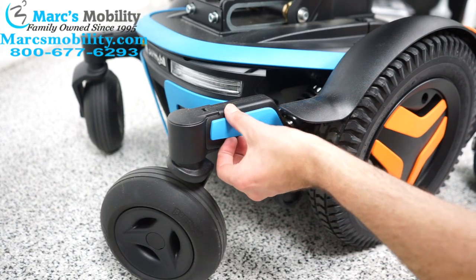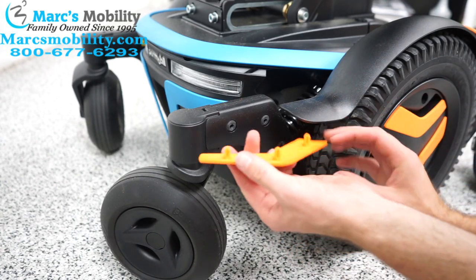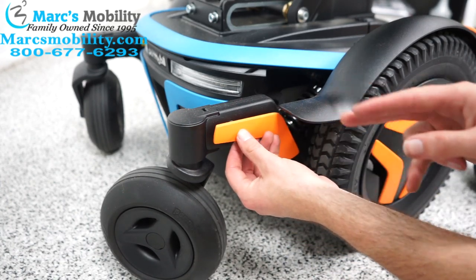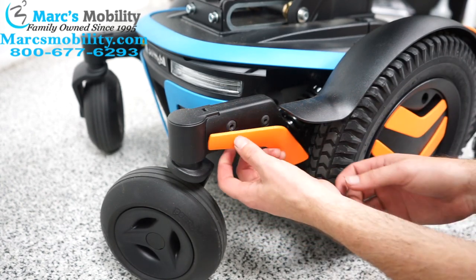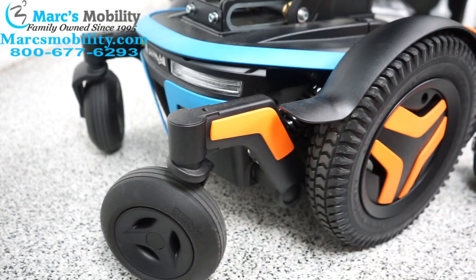Now we're going to do the rear fender. Just like the front fender, you just kind of pull out and then the new ones will just fit in. Keep in mind the front fender and the rear fender are going to be different sizes, so if one isn't fitting back here you might have the wrong one — they do look very similar. And it just pops in.